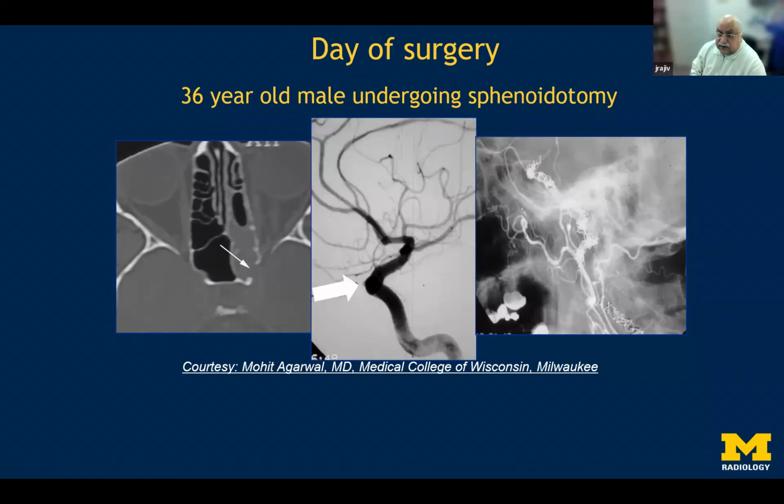Remember that this is an arterial hemorrhage. The arterial hemorrhage is at the normal blood pressure of 120/80. So you can see the amount of gushing blood that comes out, and the amount of panic that creates, because you are looking at a very small structure in a very small, confined space of the endoscope. So it is very difficult unless you immediately do this. Otherwise, the patient will have a stroke, and may exsanguinate and die if it is not managed effectively.